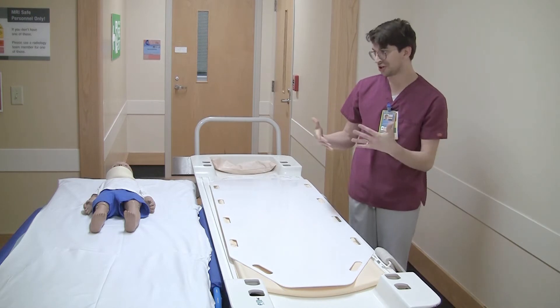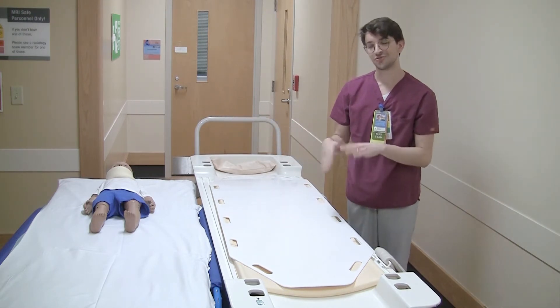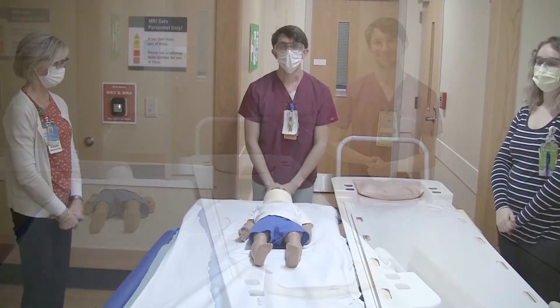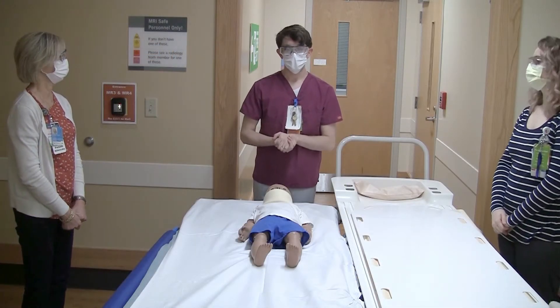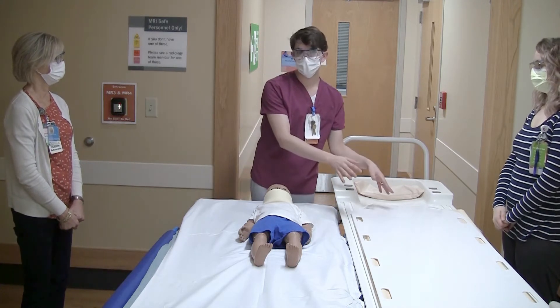In a moment we're going to show you how to appropriately and safely move the patient using the slider board. Now that I have my team assembled we can begin safely moving the patient from one bed to the other using the slider board.